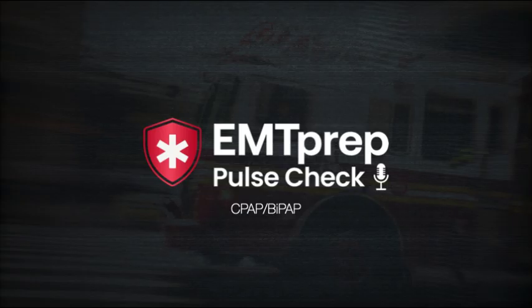So more often than not, CPAP gets confused with PEEP, or once again, positive end expiratory pressure. But CPAP's a little bit different from PEEP. CPAP provides a continuous pressure throughout the respiratory cycle, both inhalation and exhalation, whereas PEEP will provide that positive end expiratory pressure at the end of expiration, helping keep those lungs inflated.